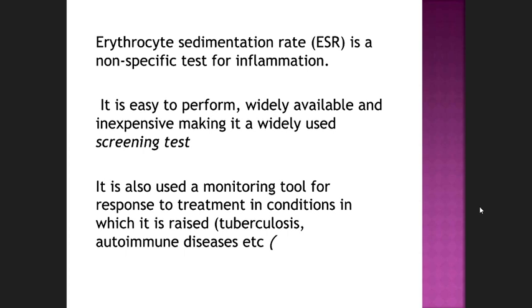Blood has RBC. Blood has plasma. In plasma, there are proteins and water. If you place the whole blood with anticoagulant in a long tube, it will try to sediment with the effect of gravity. The name ESR itself says erythrocyte sedimentation rate. So at what rate? There are factors in the plasma and factors in the RBC which will ultimately decide its sedimentation rate.